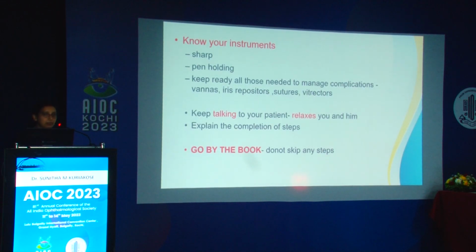And keep talking to your patient. Just keep telling them, see, I've finished this step. Now I've taken out the cataract. Now I'll put the lens. This will help you to relax. Also, the patient will also relax.